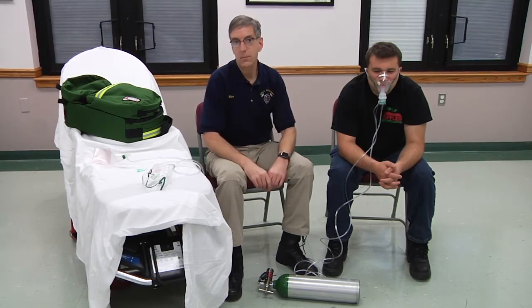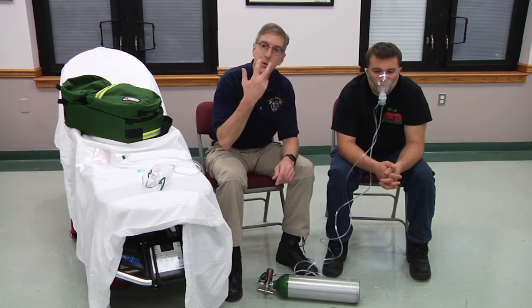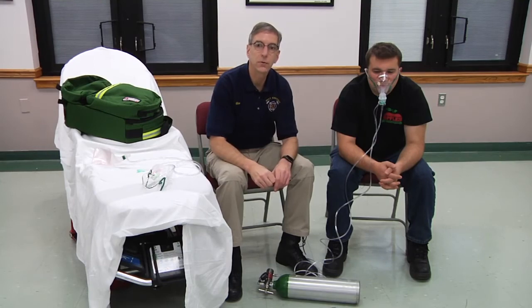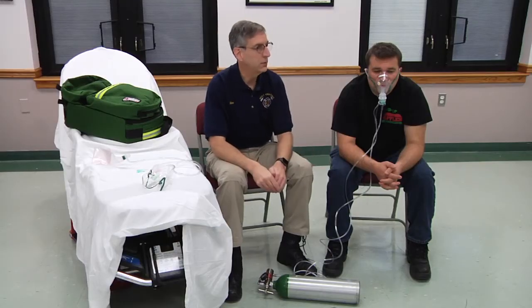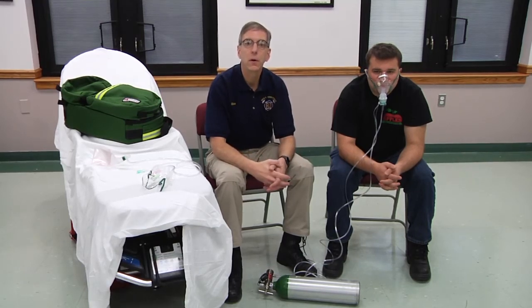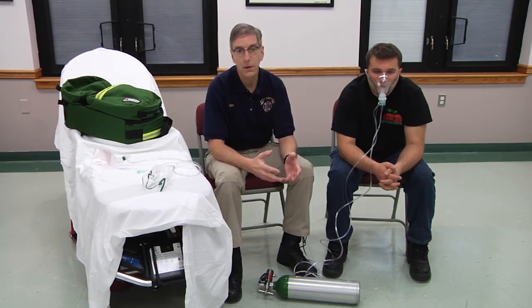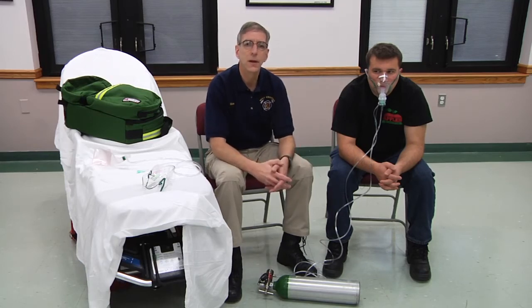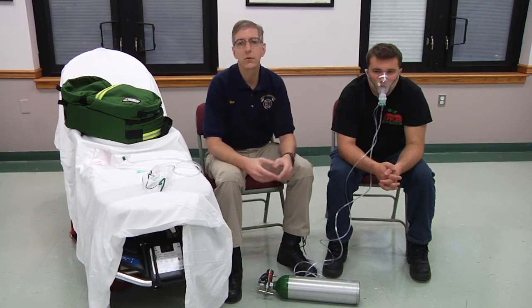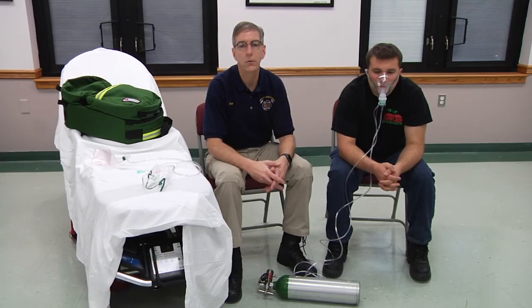A couple other things about a nebulizer, especially if you're using a mask: the patient's eyes can be irritated by the medication being delivered, so make sure the mask is not leaking medication up into the patient's eyes. Also, if you're giving a bronchodilator to a person with an obstructive pathology, you're going to see an increase in cough, an increase in mucus production, and probably an increase in wheezing as the airways begin to open up. That's a normal and desirable side effect of administering a bronchodilator.